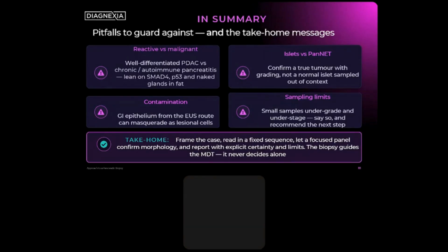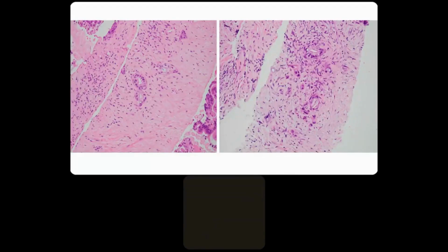Okay, so remember that the biopsy is only an important part of the decision-making tree, but it should never alone make the diagnosis unless it is obvious and diagnostic. So here's some examples of material that we get from the biopsies that are done through ultrasound. And of course, they're just pictures, and these are substantial bits of tissue which enable a diagnosis.